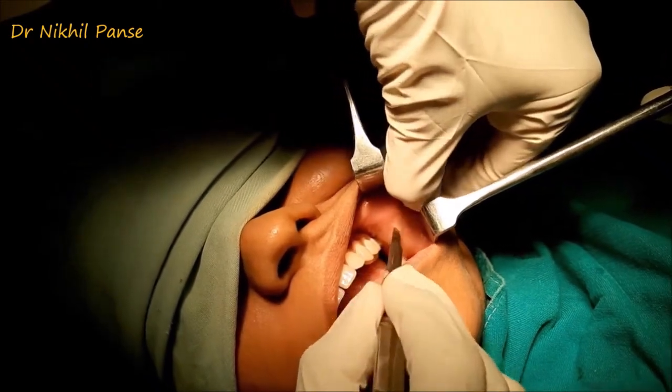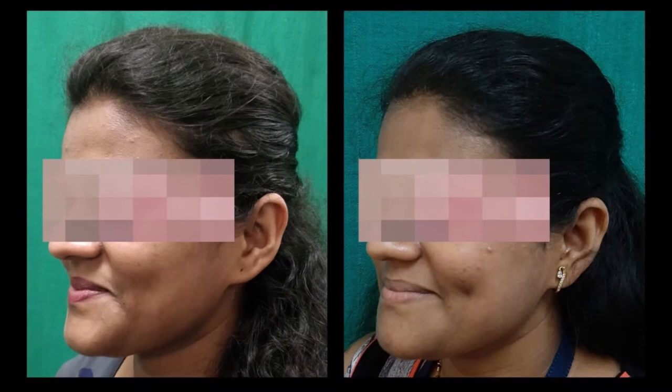Stab incision is taken anteriorly, and the neodimple is formed at the proposed site, and this is the lateral view, showing a dimple on the left side of the cheek. So this is a video showing the dimple on animation. Please appreciate that there is no static component of the dimple and it is only there in the dynamic form.